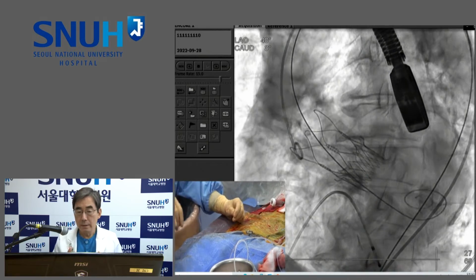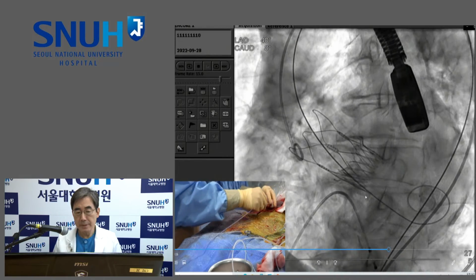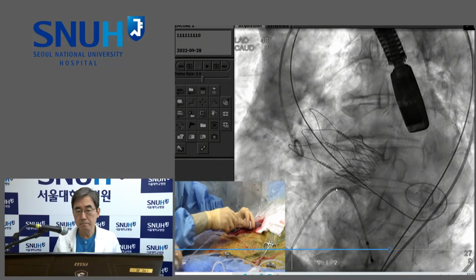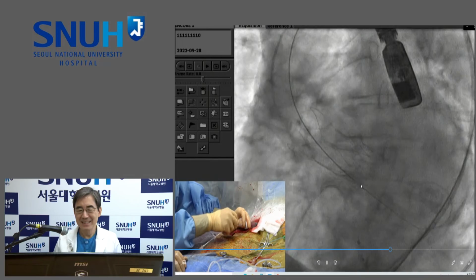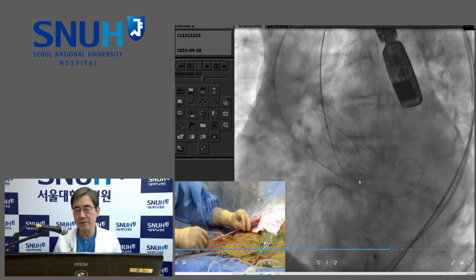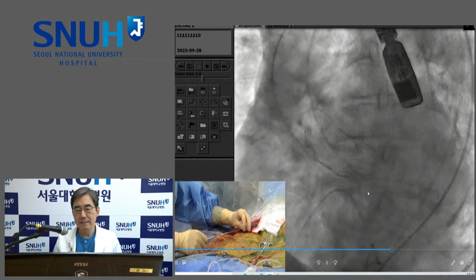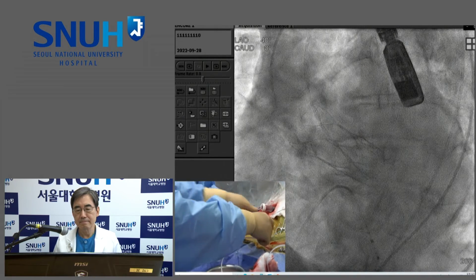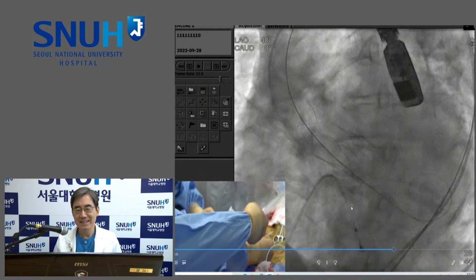In this video, actually, the upper part is not touching the aorta. It's not a problem, but it does not stabilize the valve during the procedure. It looks like that. Of course, anchoring force is maximum at the annulus level. I mean, that happens with the CoreValve too. Sometimes the valve doesn't touch the aorta in many cases, and somehow it still works, but this valve is designed to stabilize the valve by the expansion of the upper part.